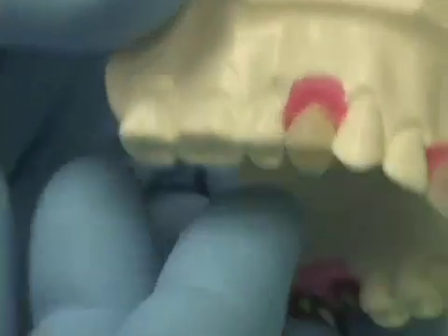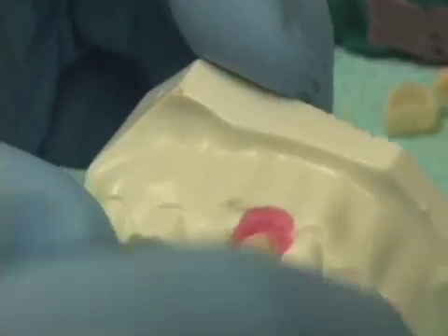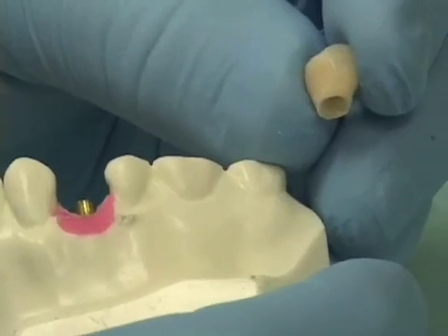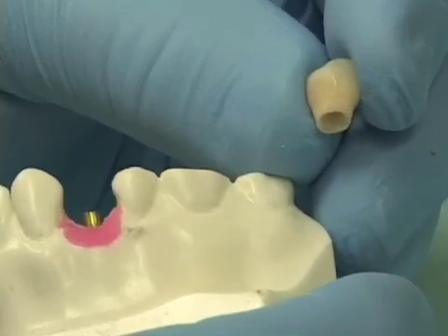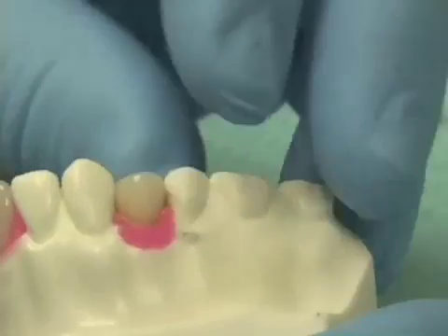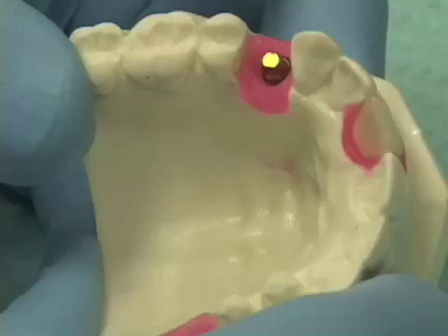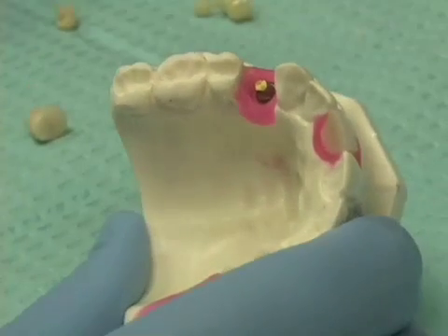What is very nice about these provisionals is they really do help sculpt or mold the gingival tissues so that the emergence profile of this provisional is better than some of the prefabricated temporary sleeves that can be fitted on. As this provisional is worn, it's literally helping to sculpt or shape the inner contours of the gingival cuff, so when we go to cement our definitive crown, it's not a difficult procedure at all.